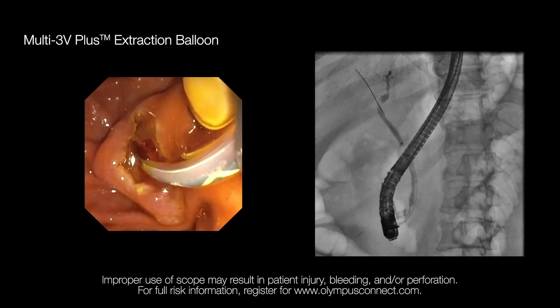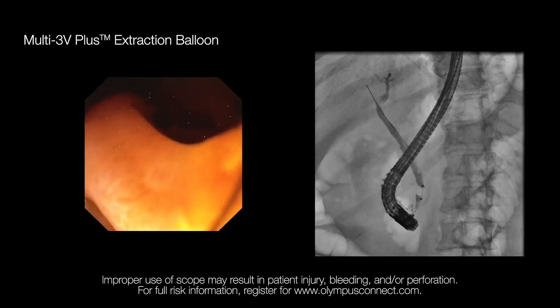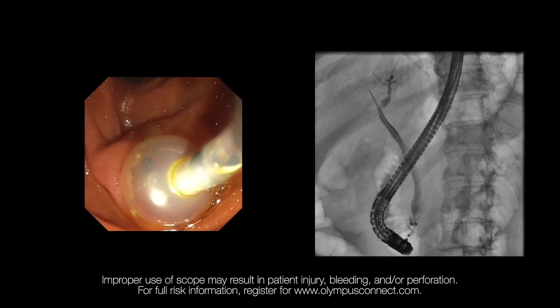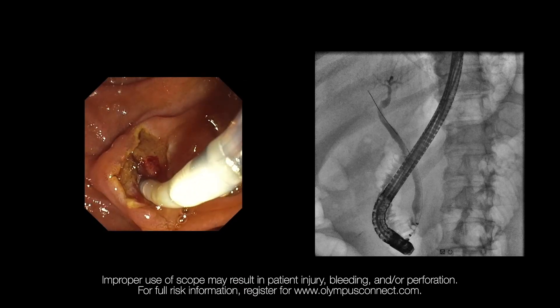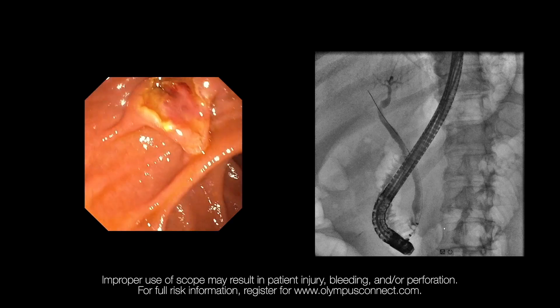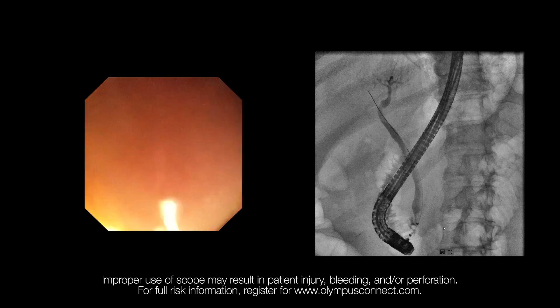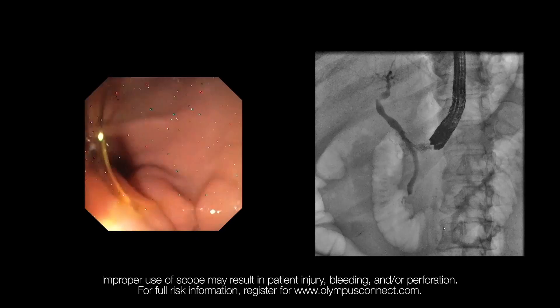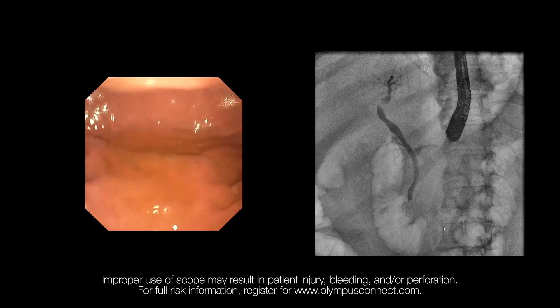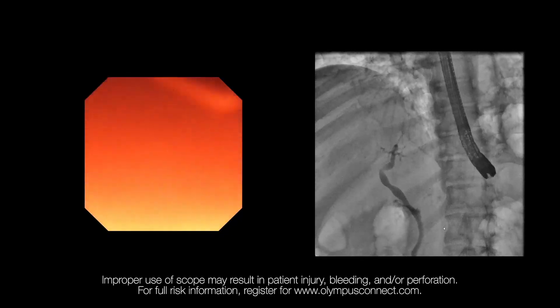Once the bile duct is clean, the wire and the balloon are retrieved. If the wheels were locked to perform ERCP, they are unlocked and the scope is gently retrieved back. Once into the body of the stomach, suction and aspiration of air is performed, and then the scope is retrieved.